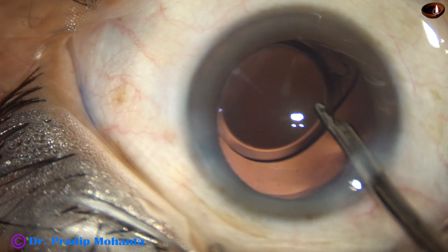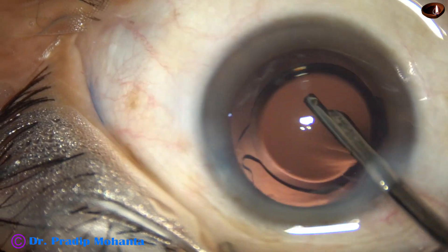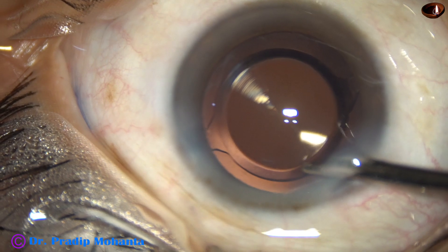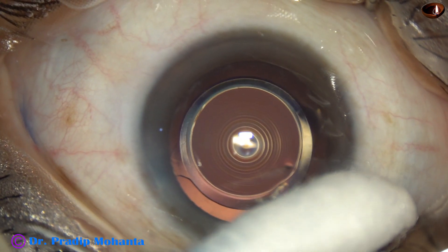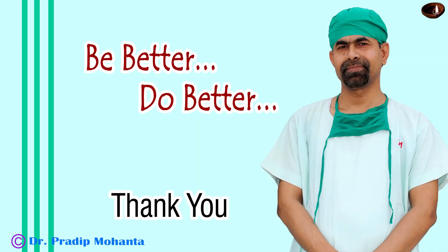Again I go behind the lens. So this has been a very satisfactory surgery. The patient cooperated well after initial difficulty, and the case is done. Integrity of all wounds is checked and the case is concluded. Thank you very much for your attention. Hope this video will help you in developing your surgical skills. Be a great surgeon and serve your patients with a lot of respect, empathy, care, compassion, and great surgical competence.